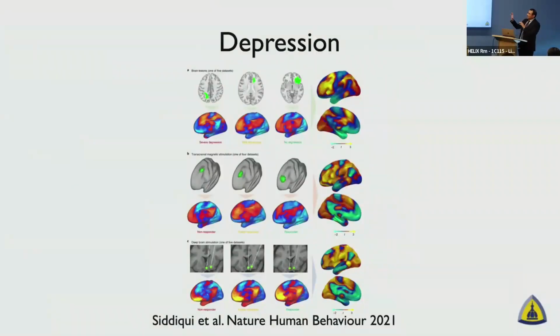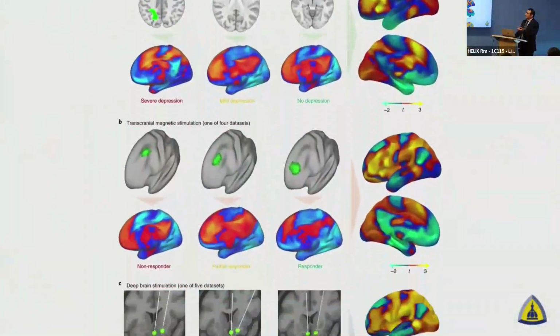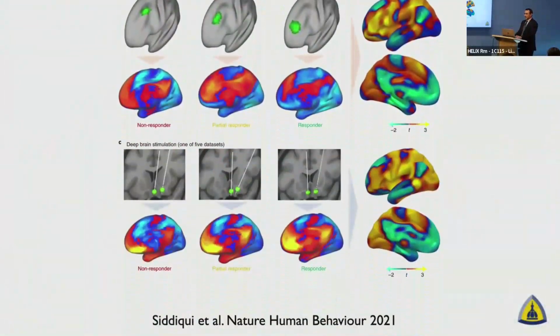So they've noticed that in patients with depression, for example, there are different patterns of connectivity based on seed-based analysis. And depending on the type of connectivity that was evident at baseline, their response to treatment actually was different. So now you can try to predict. I'm going to go through this a little bit quicker because of time.